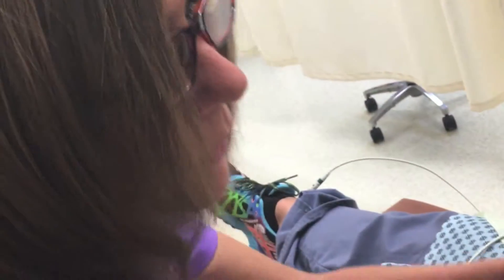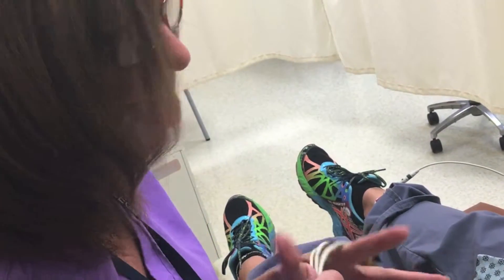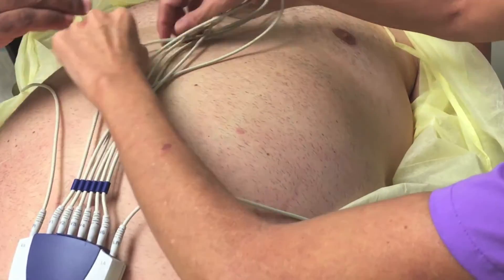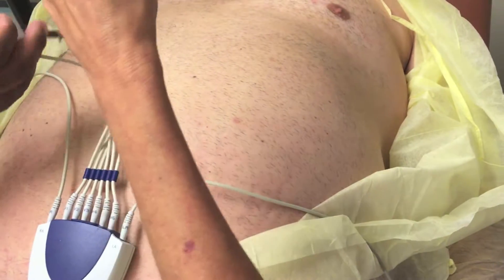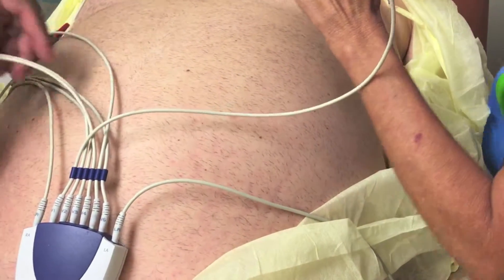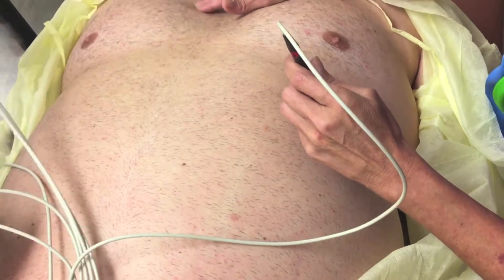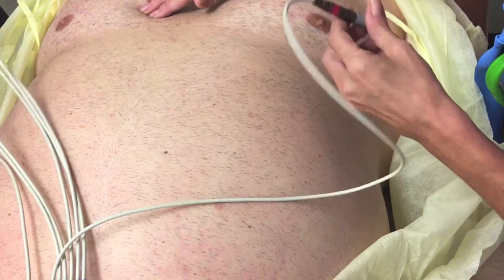Now is when we're going to have to open the front of your gown a bit. We are going to have to place electrodes on your rib cage and on the outside here. V1 needs to go on the 4th intercostal space at the right border of the sternum. You do this by counting the spaces in between — that would be 1, 2, 3, 4 — and place the sticky tab right there.